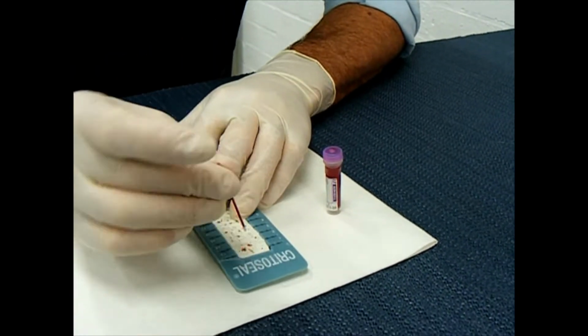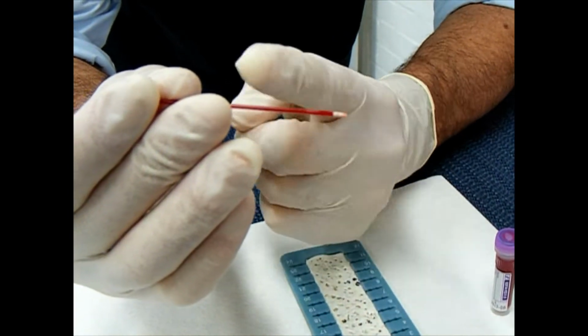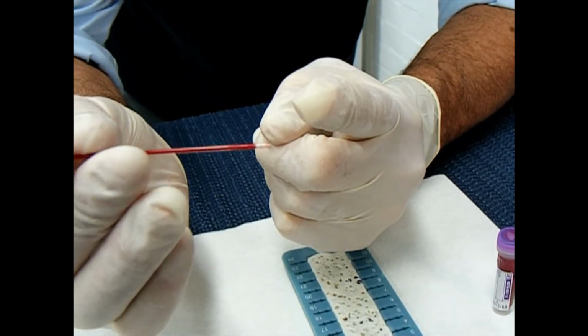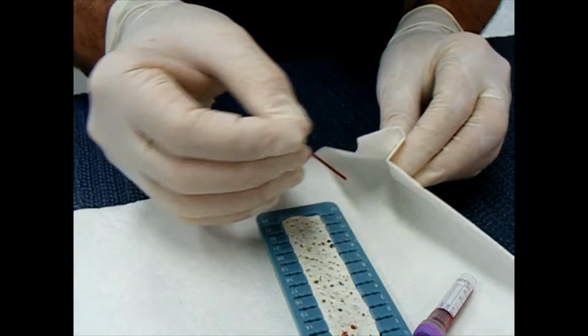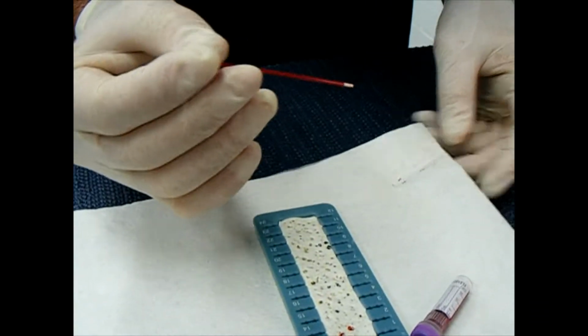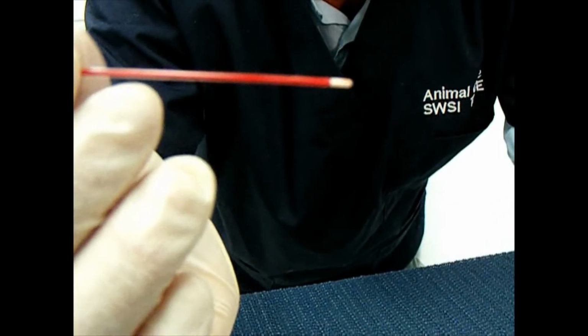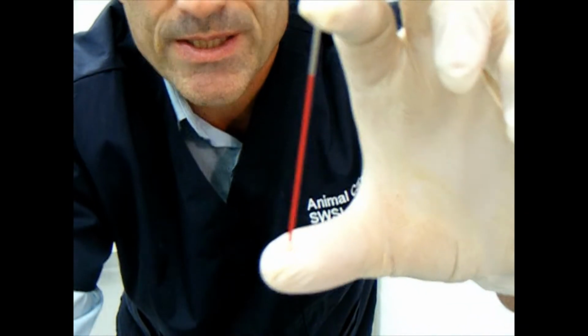Now what you'll see is that there's a plug in the end of the tube, and you want to plug at least that big, maybe a couple more to make it a bit bigger. At this stage you can clean the outside of the tube to make sure it's clear. And that's the first step in the process.